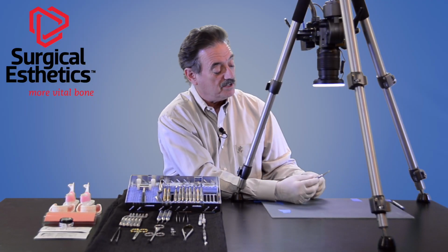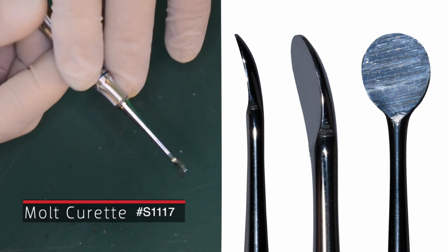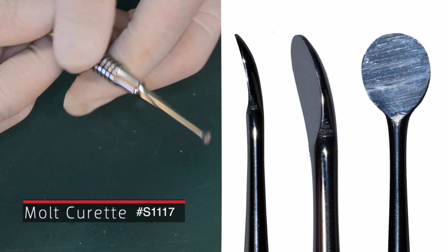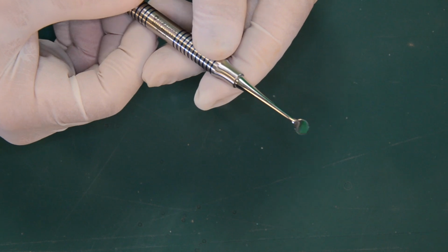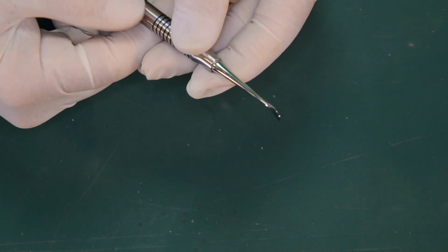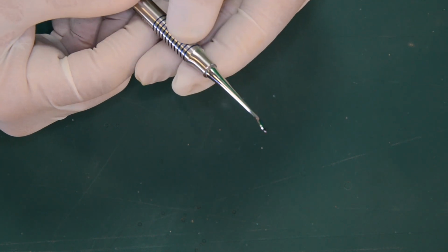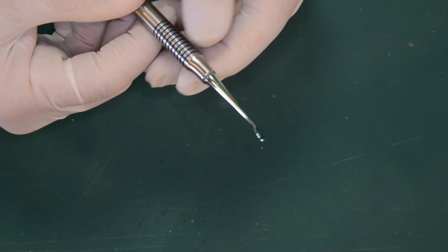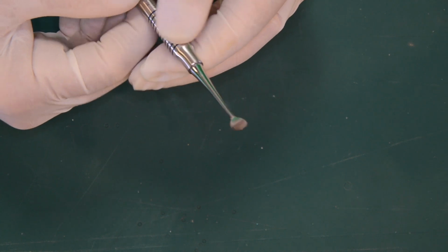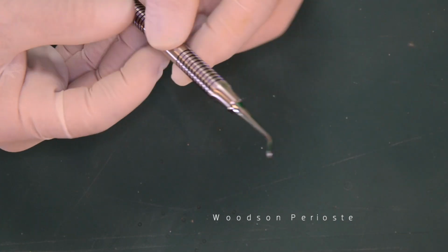Again, our workhorse is the Molt. The Molt is a two-sided instrument, dual ends. One is a smaller end, the other is a larger end. The Molt has a number of uses. We also use it to deliver bone graft material to the site, but it's a great instrument for being able to raise a full thickness flap without inadvertently tearing the flap and doing a partial thickness, leaving some of the periosteal behind.